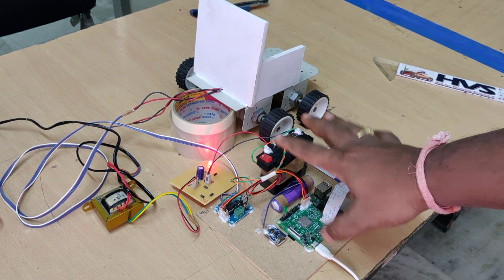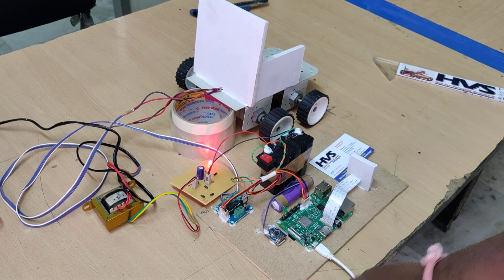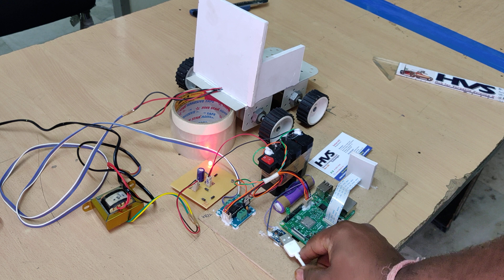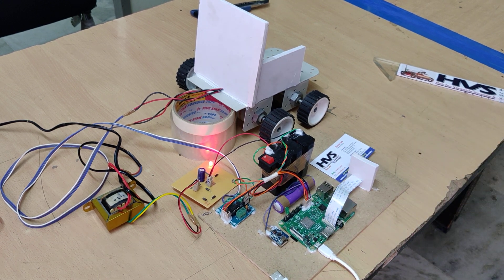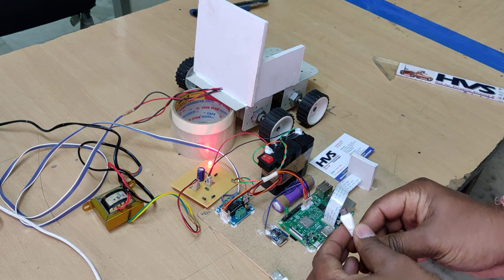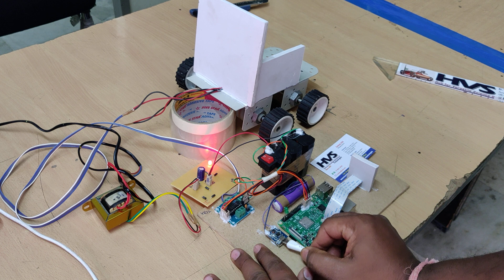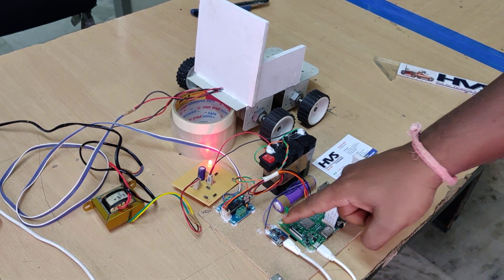This is the main on/off switch to run the DC motors and the Raspberry Pi. To charge the lithium-ion battery, connect the B-type charger here. An LED indication will show charging status.